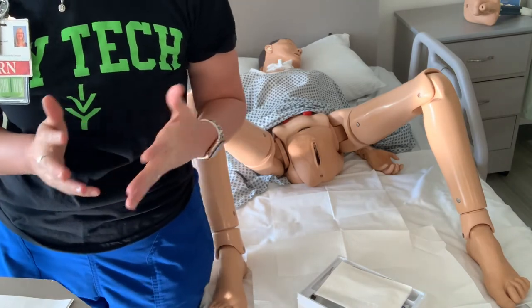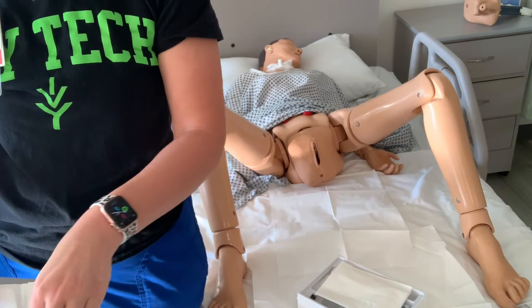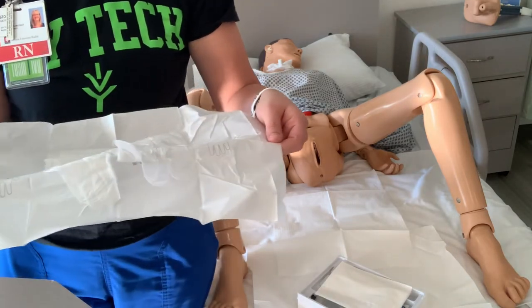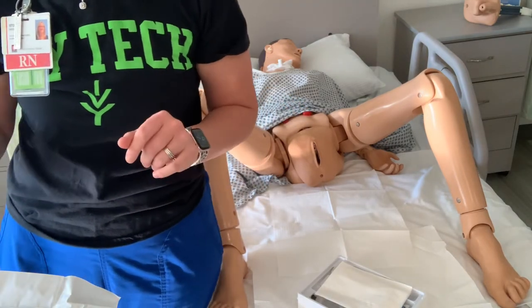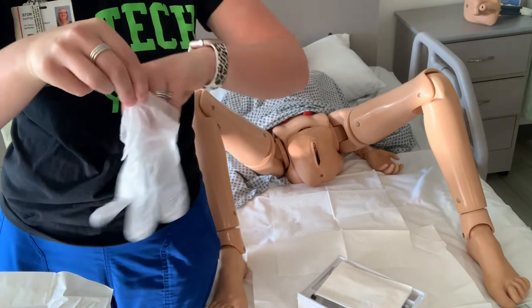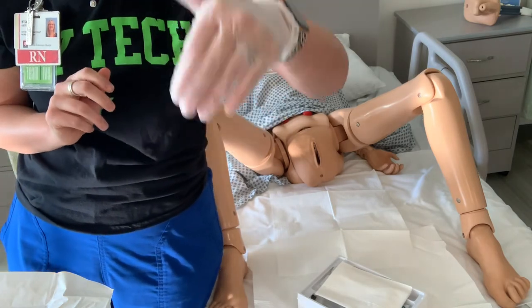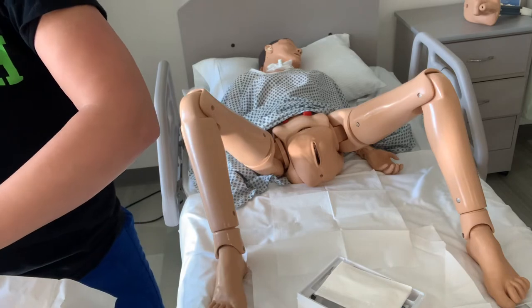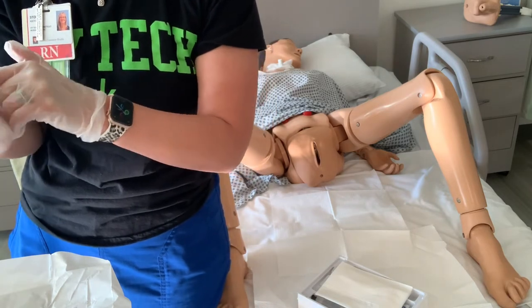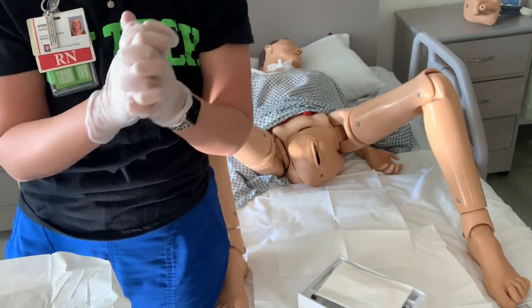The next step is to put on our sterile gloves — we all know how to do this already. Being careful when I open the package that it does not flop back to contaminate, only touching that one-inch margin. Grabbing the cuff of my left hand glove, I slip my hand in there, and then use the sterile glove to scoop into the next glove — not using our thumb so we don't graze our hand. Pulling that on, making sure our cuffs are up and over, keeping us safe, secure, and sterile. Now we're sterile.